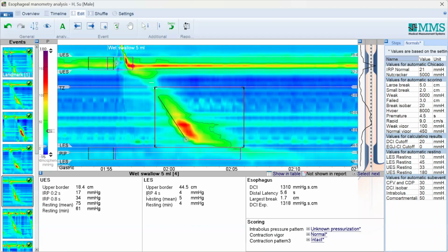To be very accurate and confident that this is the IRP, it's considered correctly before I give the final result. And this is what we were talking about before recording: this is where the use of EndoFLIP has come into practice, where we can measure the distensibility index and the diameter, pre-procedure and peri-procedurally as well, to ensure that whatever we did, whether it's a myotomy or a POEM or anything else, has had a proper effect on the patient.